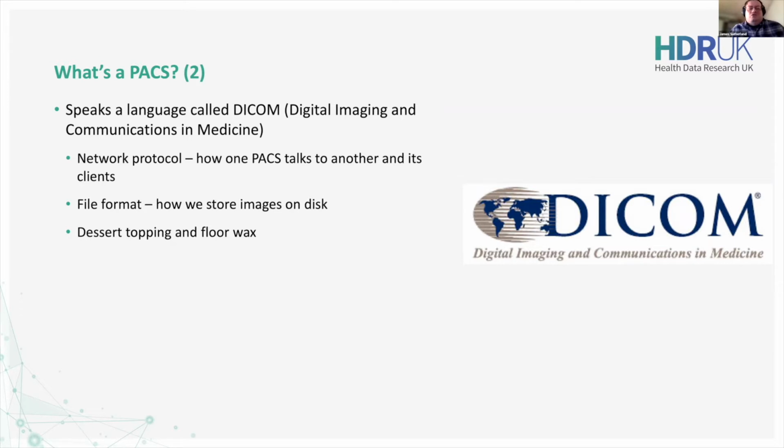And it's not quite a dessert topping, but it does encompass a lot of other aspects. There are standards for exactly how different levels of gray appear on screen. Obviously, that's quite important, in that in medical imaging a small shadow could be clinically significant or not. It's very important you have a very accurate and consistent reproduction of images. And it has standards for printing images out, putting on CD, moving around, all sorts of other things.